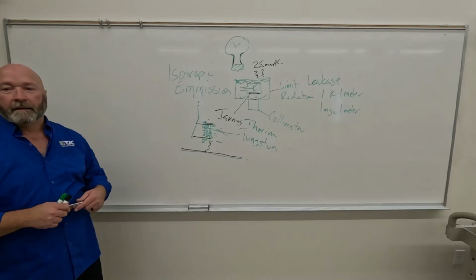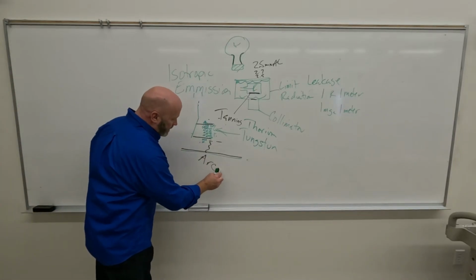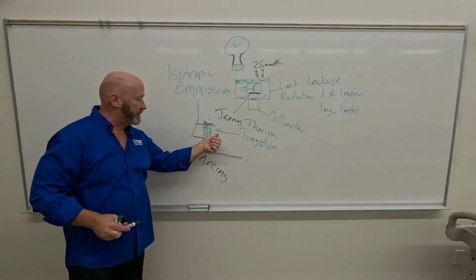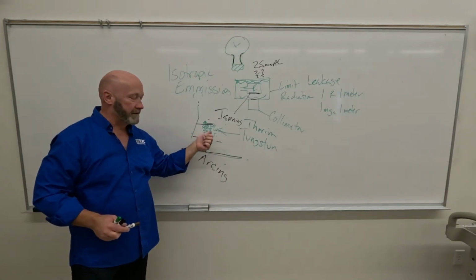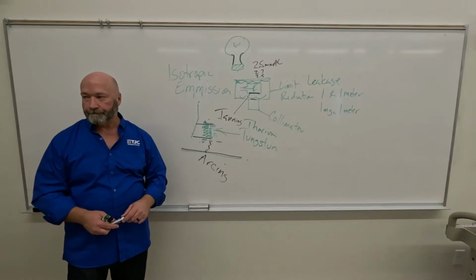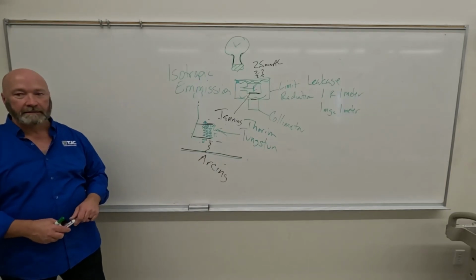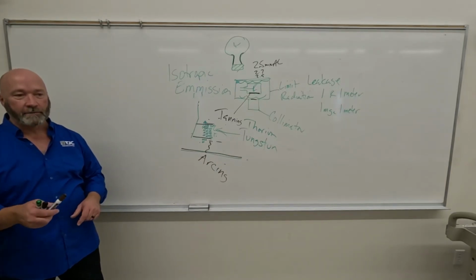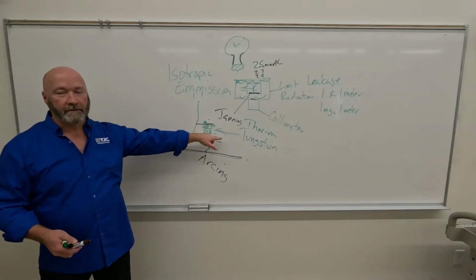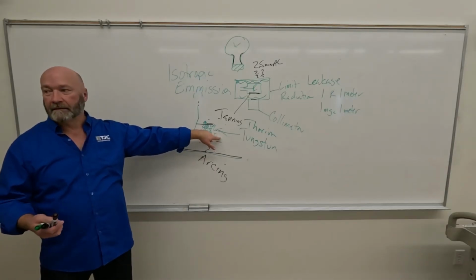Okay? That's arcing. That's what we call arcing. Arcing is, again, where the electrons don't go from cathode to anode, but some of them go from cathode to the glass. Now we got a short circuit. So what caused the short circuit in this case? The tanning, which was caused by vaporization of the filament, probably a little bit of the anode too, which was caused by heat.